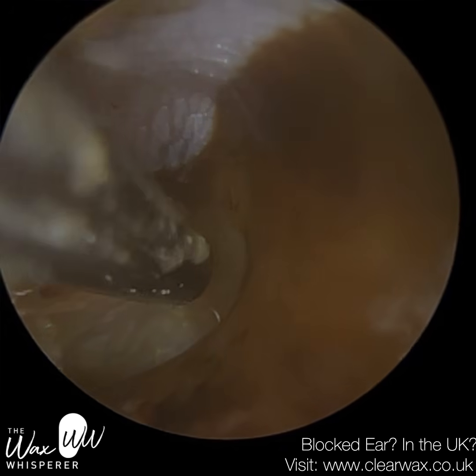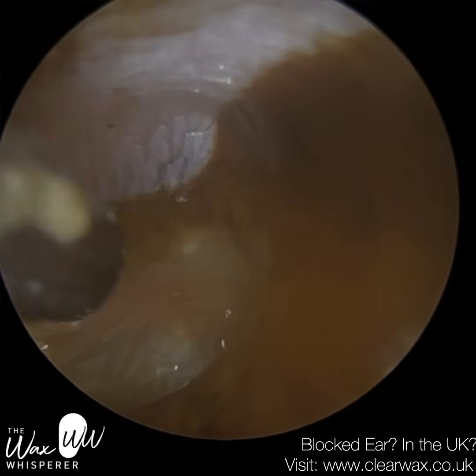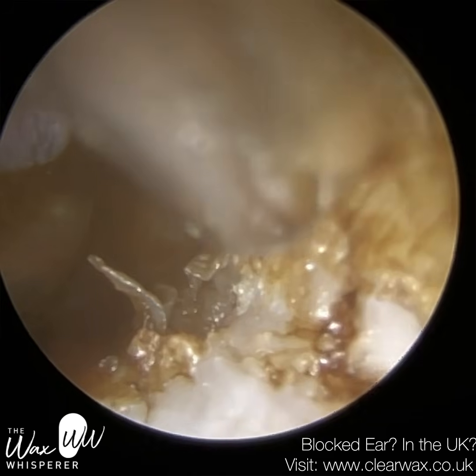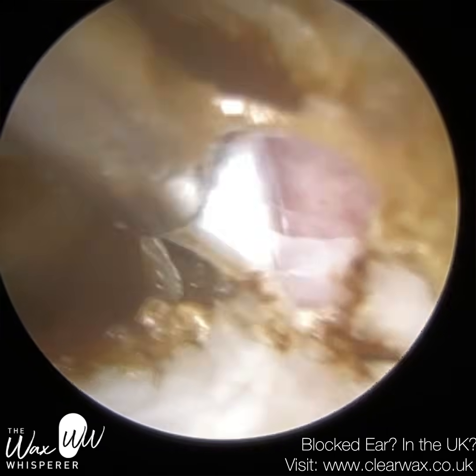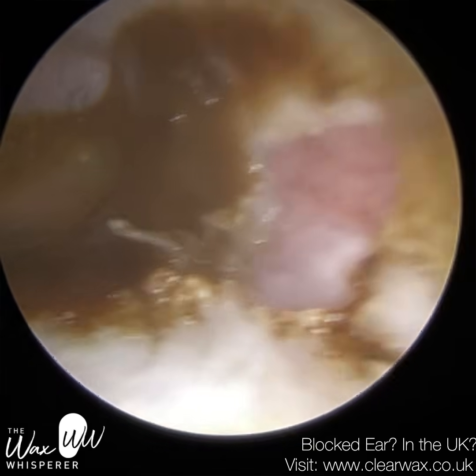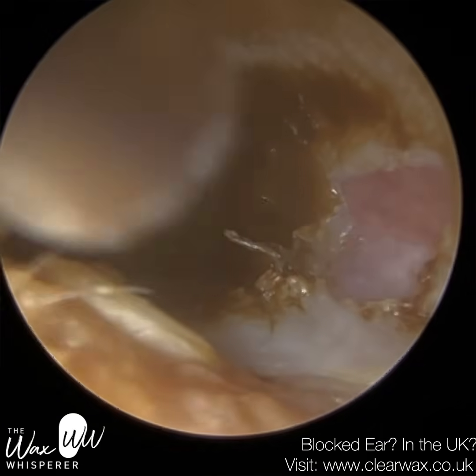Now, the epidermis layer replicates itself, it then dies, and it's replaced by the layer of skin that it's reproduced. And that dead layer of skin should then naturally migrate out of the ear, almost in a conveyor belt motion. And as the skin is migrating out of the ear, it should exfoliate, it should break up into the individual skin cells. But in this case, you can see the skin has died, it's failed to migrate, and it's also failed to separate. So we've still got these long sheets of dead skin.